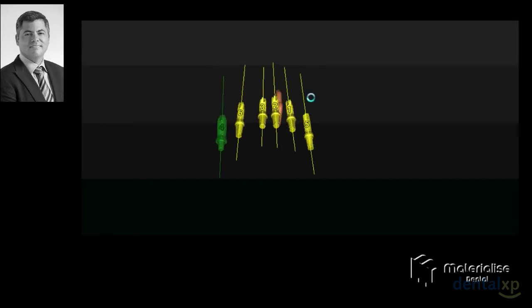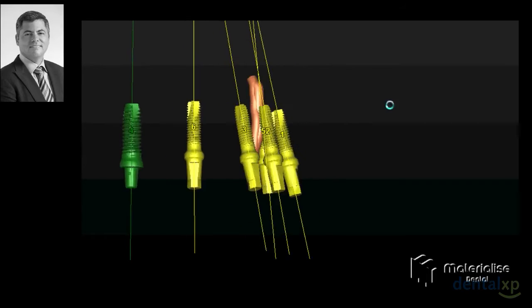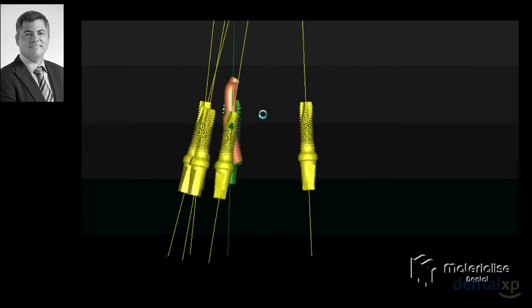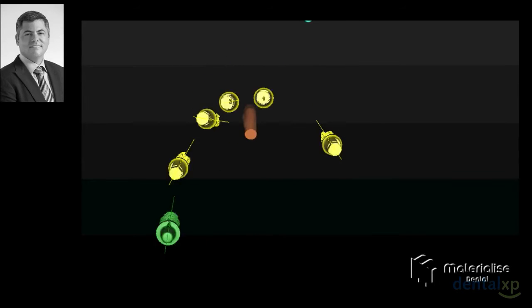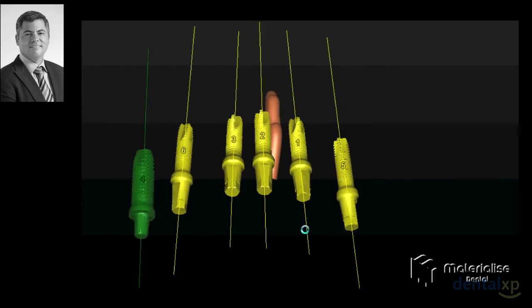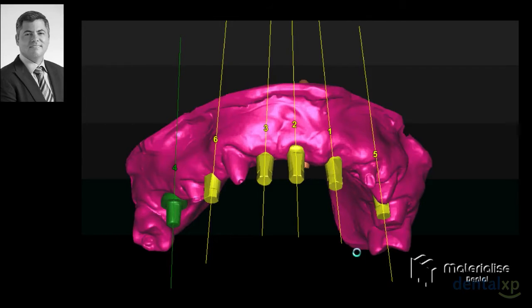You can here appreciate a video that shows the final positioning of the implant, the reference of the nerve in relationship to the upcoming position of the implant. As you see, these zirconia implants are a monoblock implant. There are now 2-piece implants being fabricated.